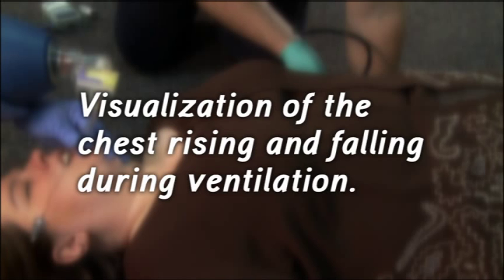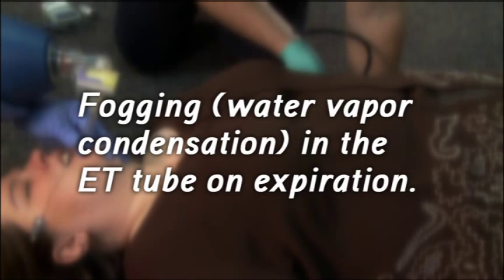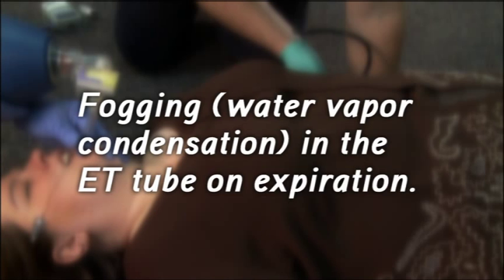Additional clinical assessments include visualization of the chest rising and falling during ventilations, and fogging or water vapor condensation in the ET tube on expiration.